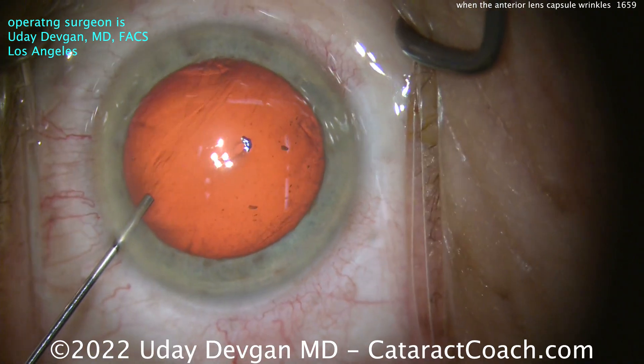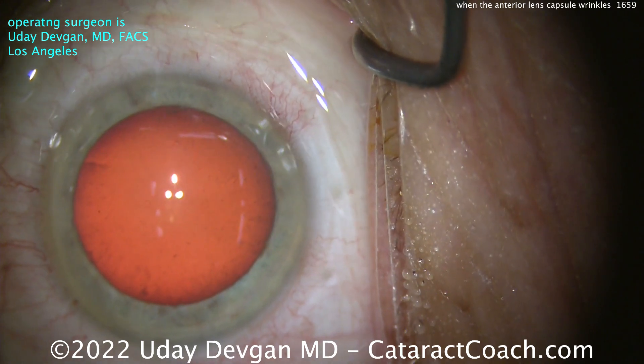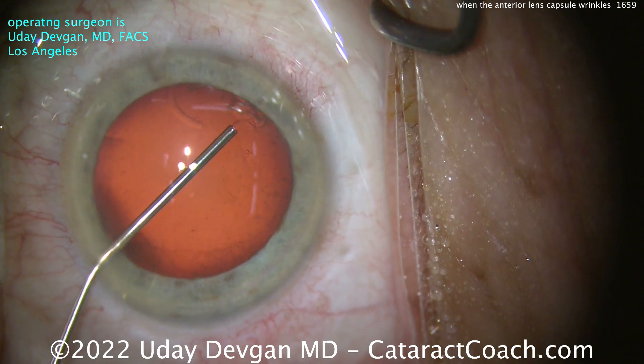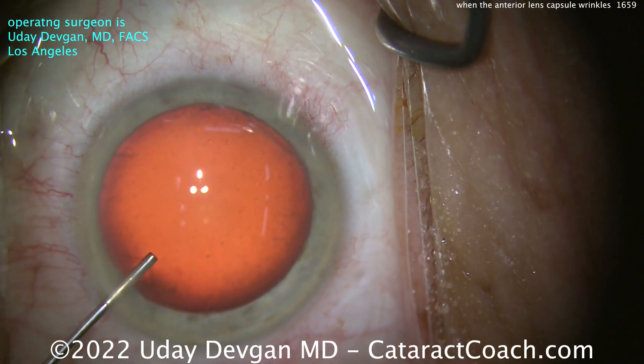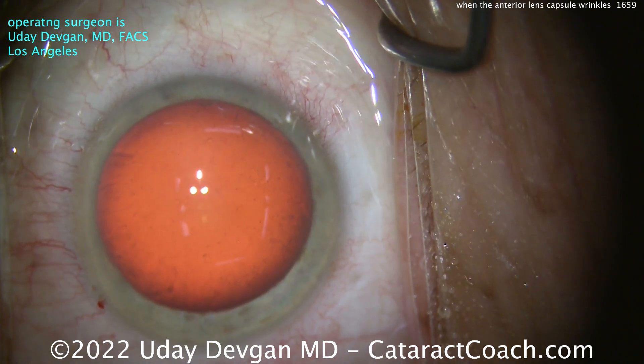There's the paracentesis. Putting some anesthetic in, everything looks pretty normal. Good dilation, no history of any prior trauma. Put our viscoelastic in, and again, everything looks pretty normal — normal AC depth. I don't sense any zonular laxity at this point.